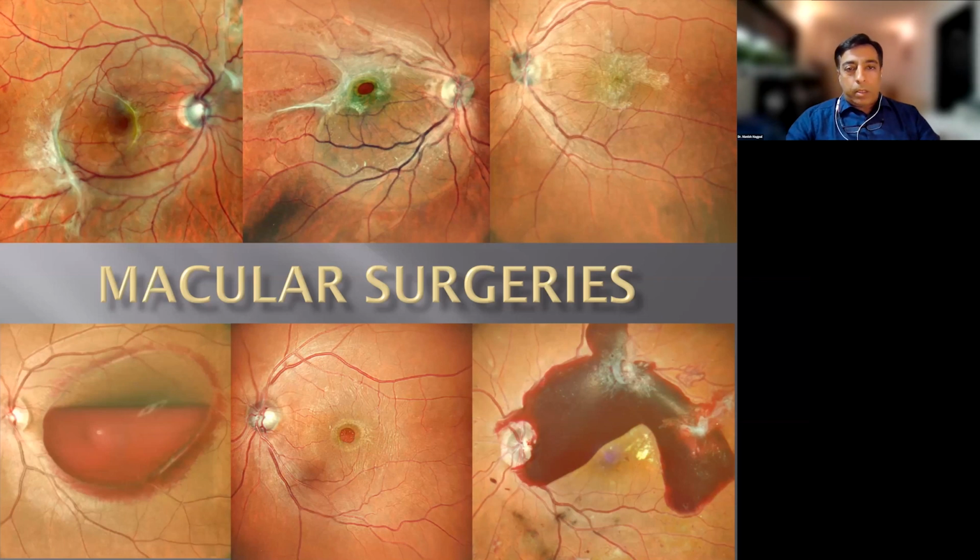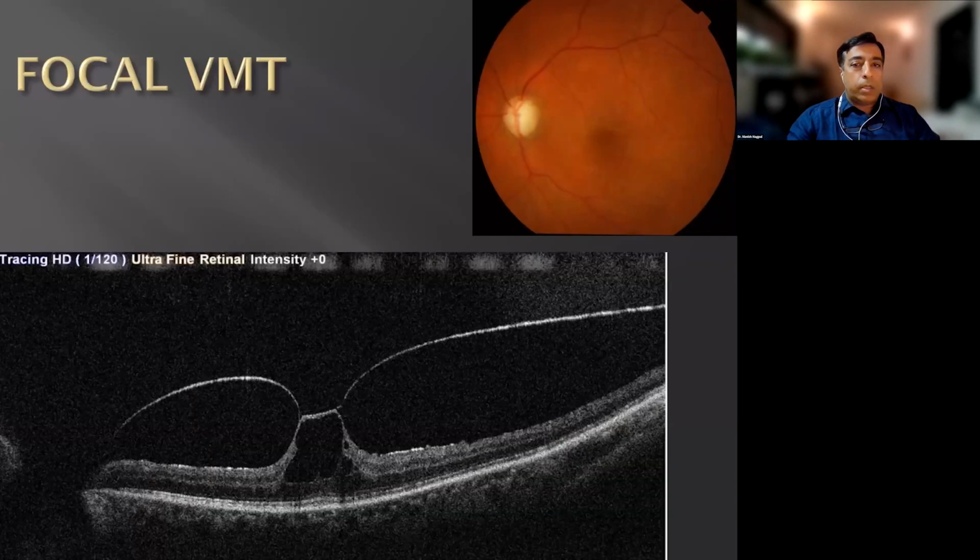Also, a few complications that commonly occur and how we handle them, and then look at the whole variety of situations that encompass the macular surgeries.